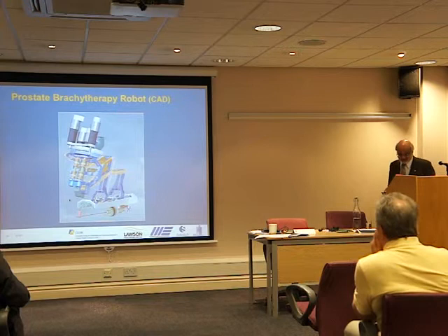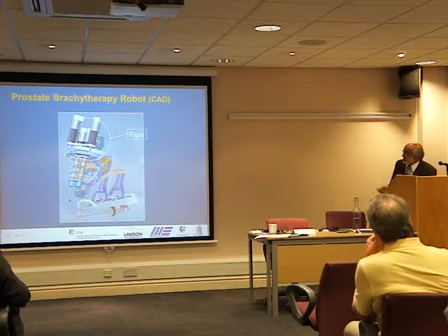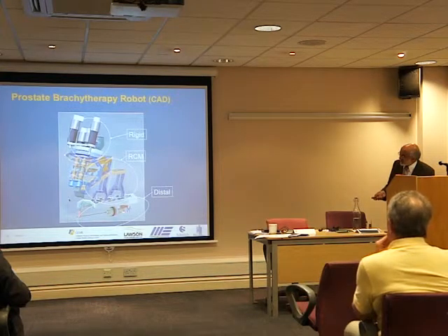And this is a CAD model of the system that we designed. All the parts shown here do not move. This double parallelogram here creates the remote center of motion so that the needle tip can be pivoted about the point of entry. And at the distal end, we have a motor that pushes the needle in, and another motor that drives it and rotates it.